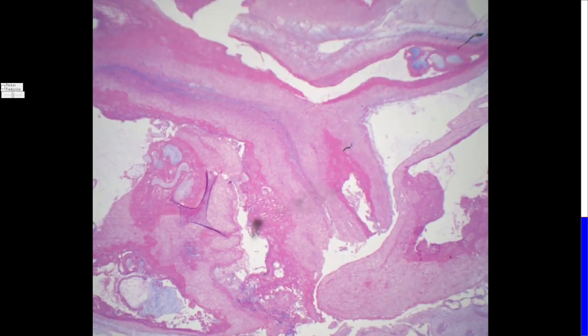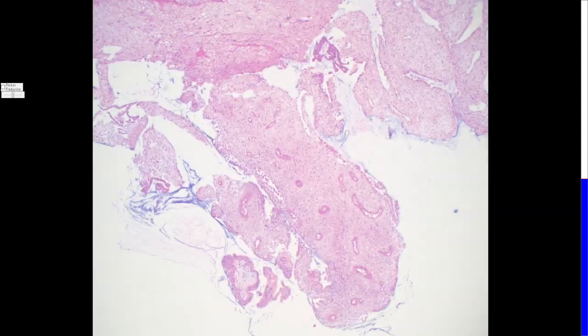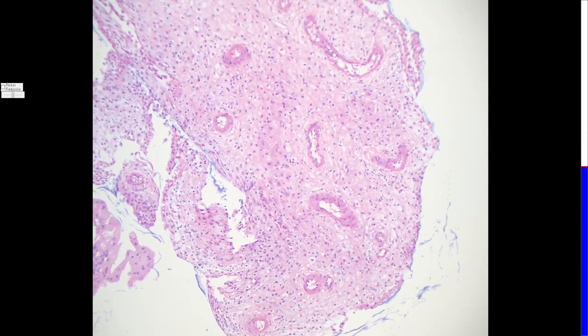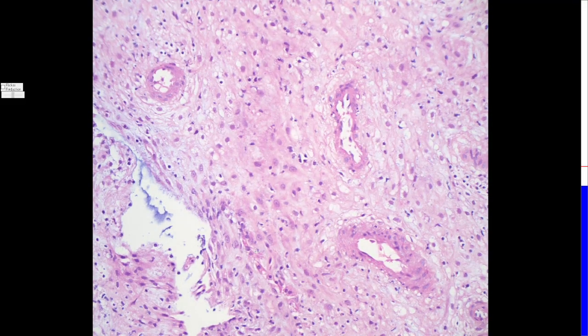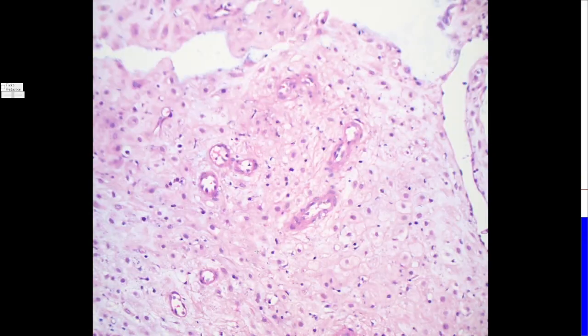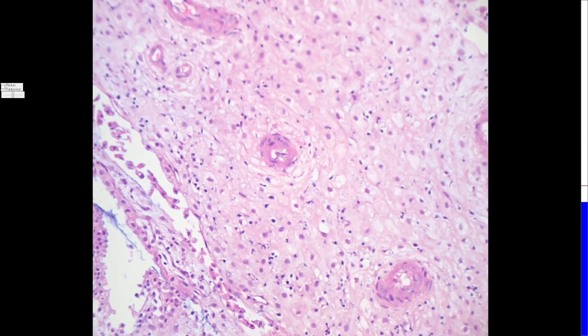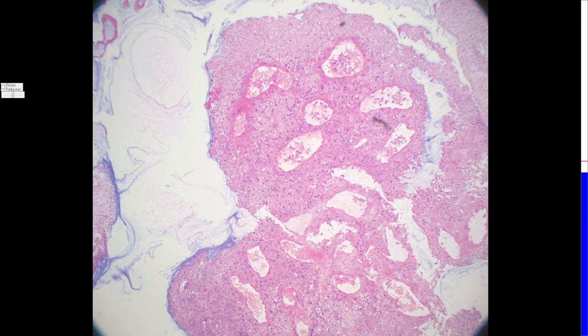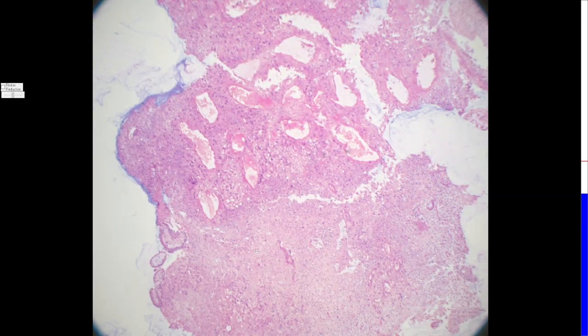And then we have the endovascular trophoblast, extravillous trophoblast. So let me show you what happens to the vessels at this stage in pregnancy. So in some areas on a POC specimen, we're going to have these arterioles, which are the spiral arterioles of the endometrium. And they look pretty normal, right? They have muscular walls and a constricted lumen. But this is in contrast to this area here.